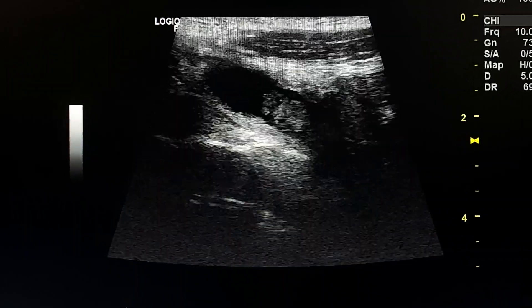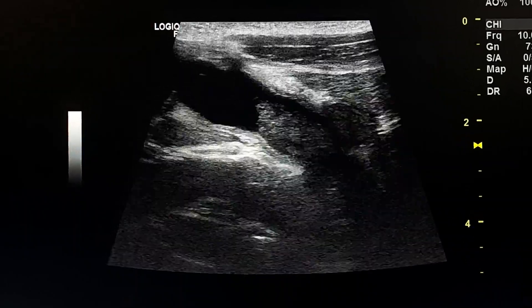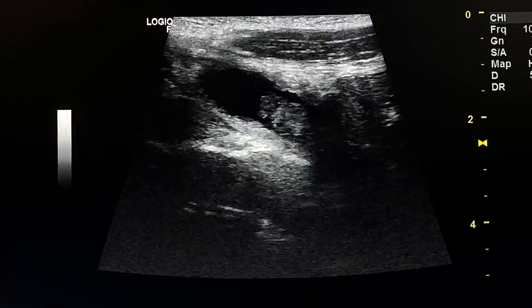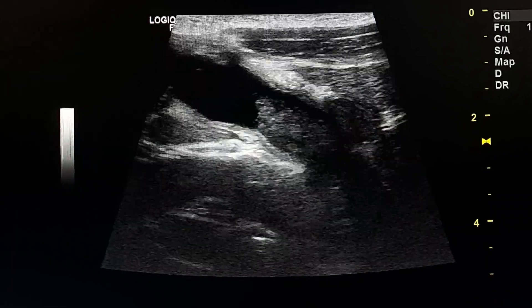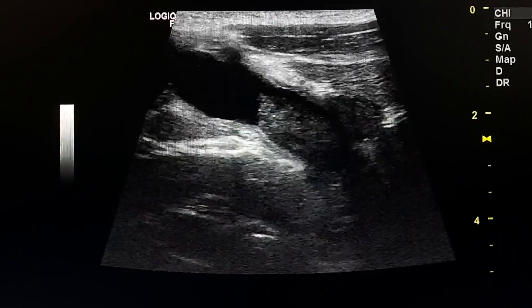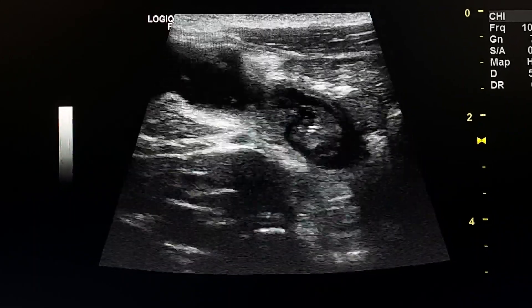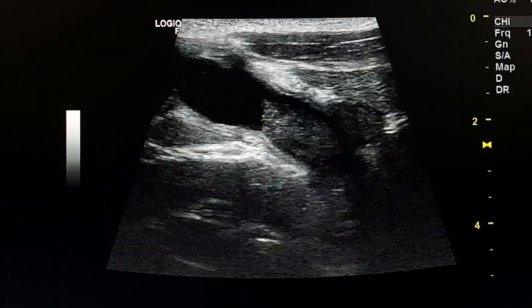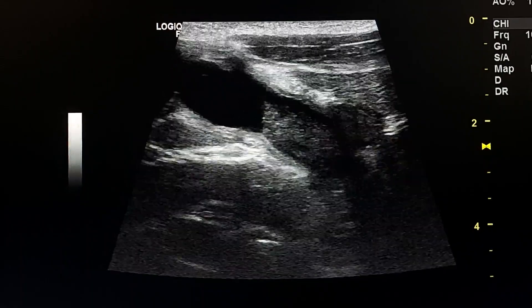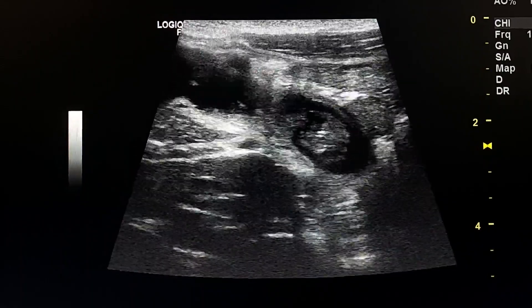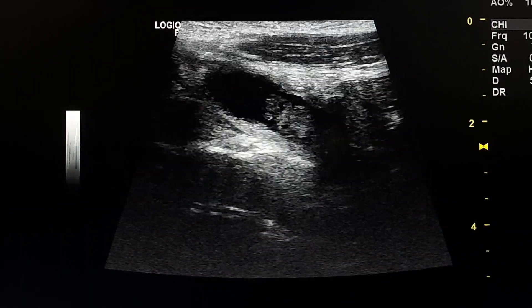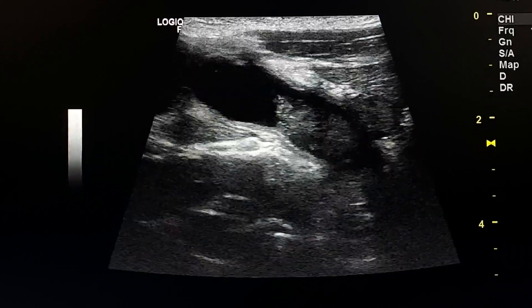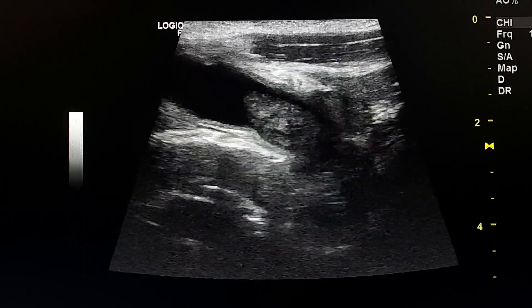This is an ultrasound exam of a 12-year-old male child who presented to the emergency room with right lower quadrant pain. After surgery, a Meckel's diverticulum volvulus was discovered. This is the distended Meckel's diverticulum.